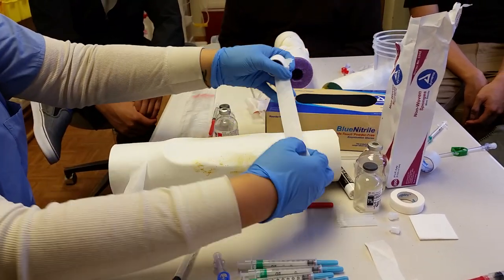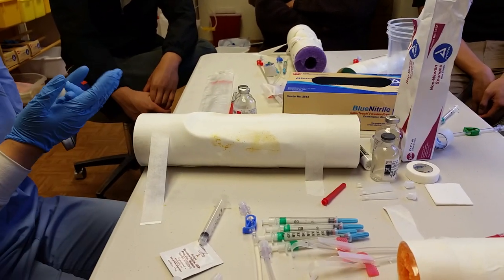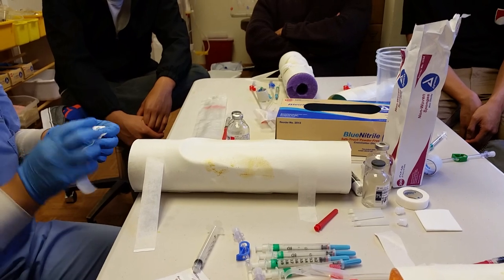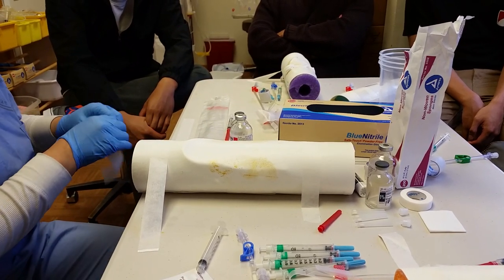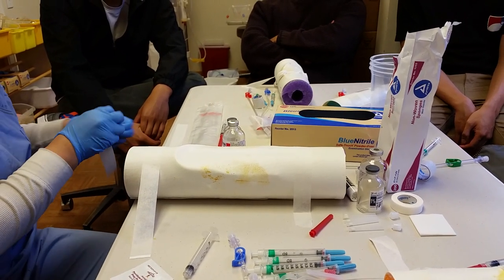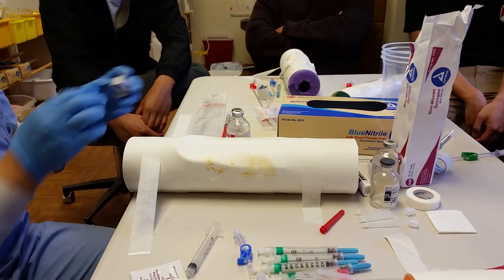You always check the orders too, to see what type of needle they use. These are 17 gauge needles — if they have 16 gauge or 15 gauge needles, they have a graft. Check the heparin order, check to see if they use lidocaine. Sometimes you have patients that are allergic to iodine, so we use alcohol, or at my place they use this antiseptic called chloroprep.